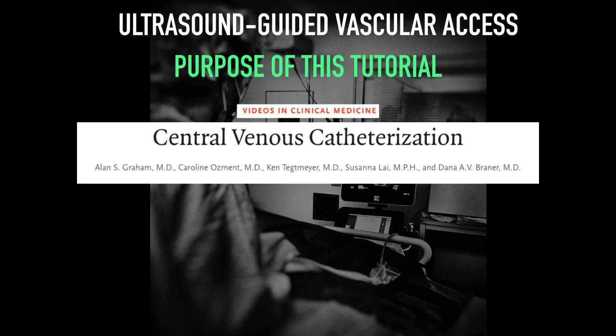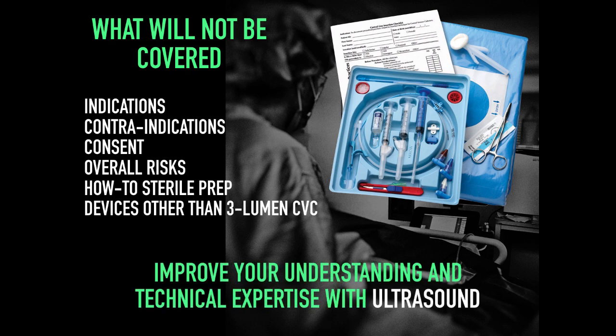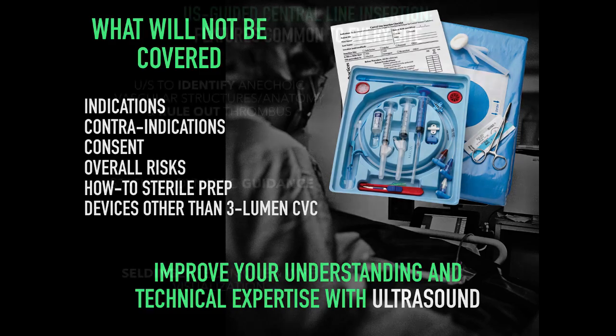However, in this video, there is not proper attention paid with respect to the use of ultrasound, as it enhances the procedure, but it also adds a measure of complexity. We will not cover indications, contraindications, consent, risks, sterile preparation, and devices other than a triple lumen central venous catheter. We hope to keep this video brief and concise and improve your understanding and technical expertise with ultrasound.